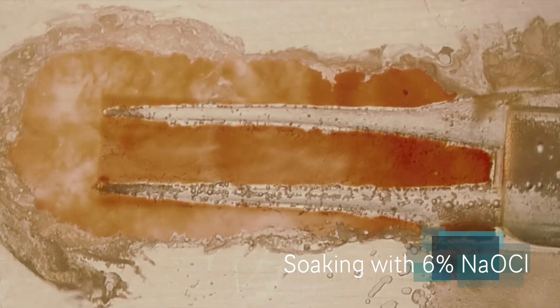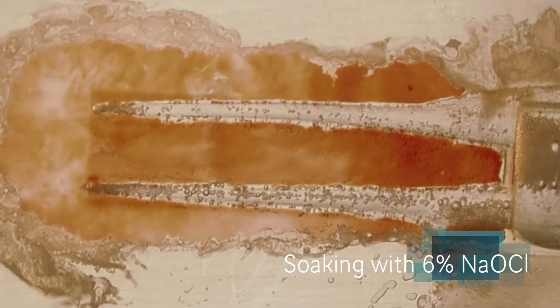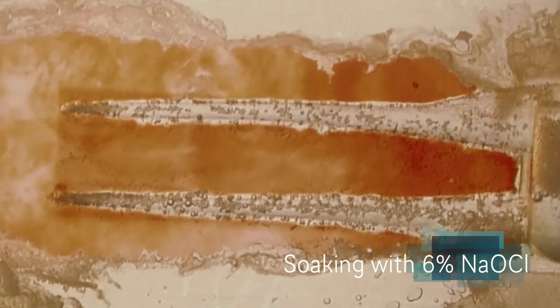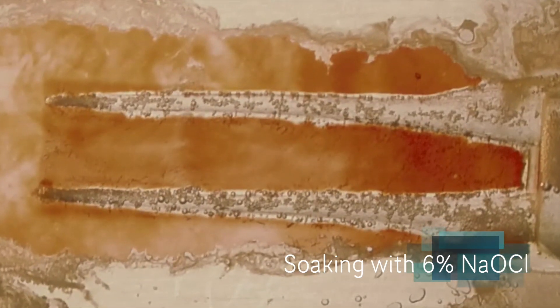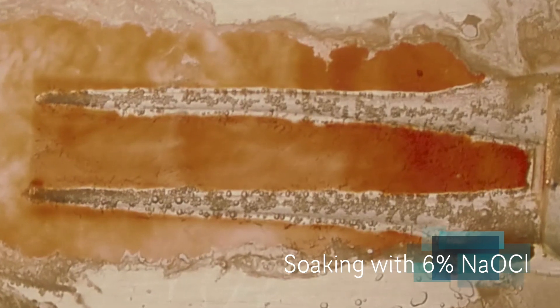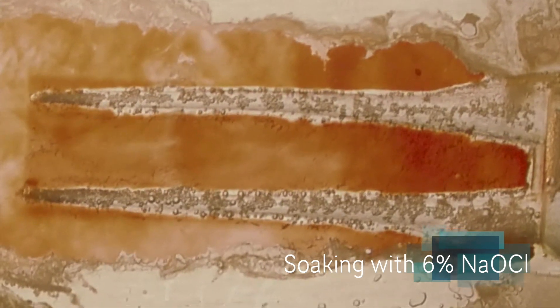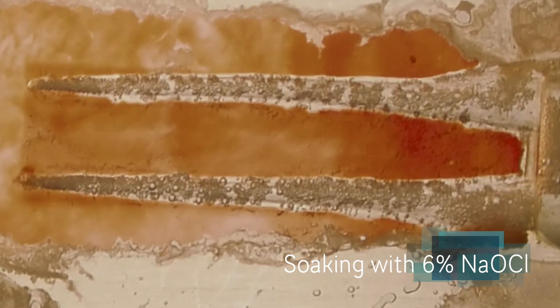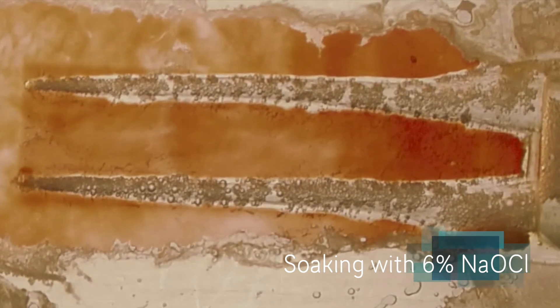Actually, the best time to soak with hypochlorite is after the shaping is done because, take a look at this. Once you have a canal that has some shape to it, even subtle, slight shape, there's enough hypochlorite in there to seriously degrade the pulp tissue.